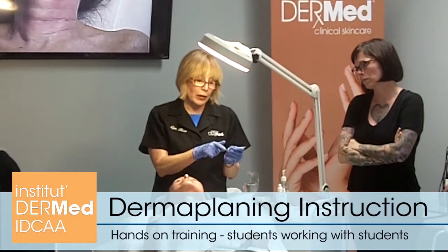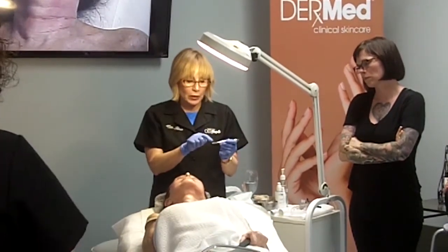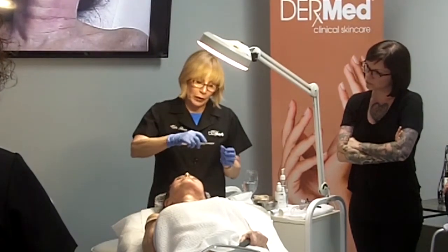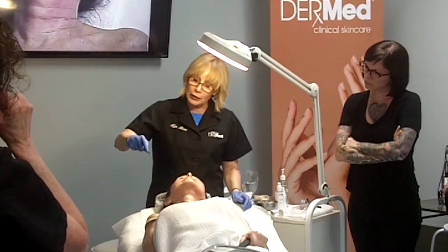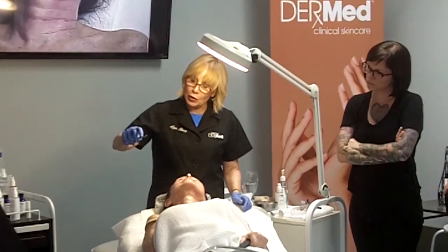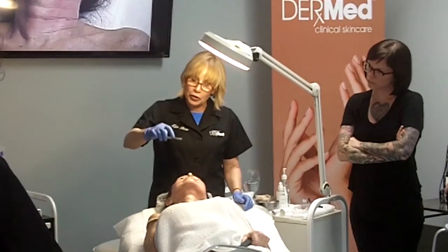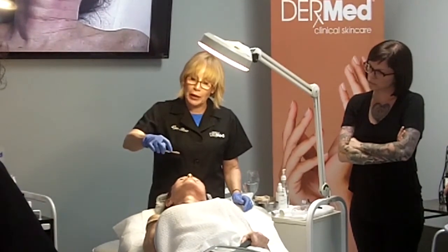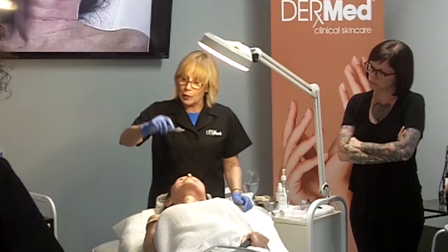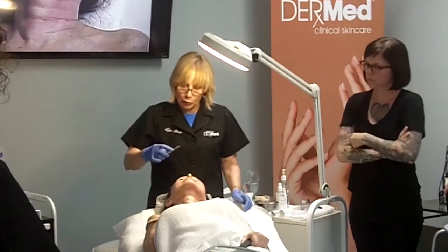There's a bit of space here at the end of the blade. So you have this, then you have this one surface. Now this I do overhand. I put my finger right here where the blade is, choked up on it where the ridges are, my finger right over the blade. I touch down with the blade at about a 45-degree angle, and then I drag it with my shoulder. I'm not putting a lot of pressure, I'm just rocking with my shoulders.